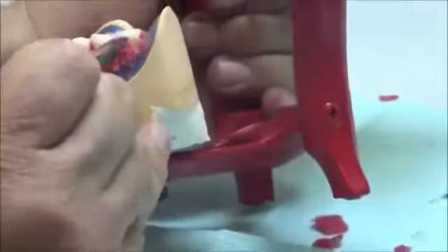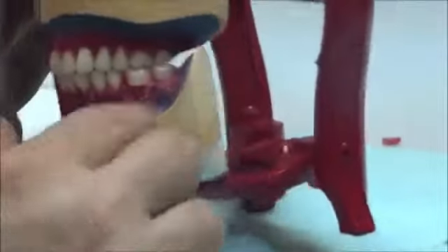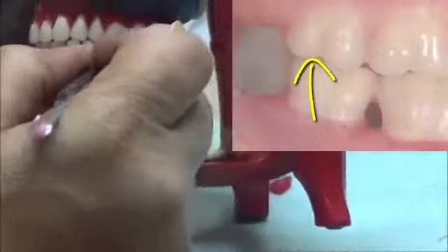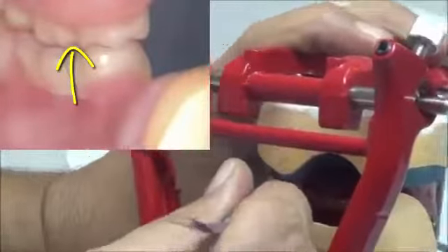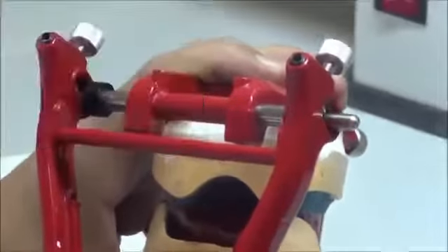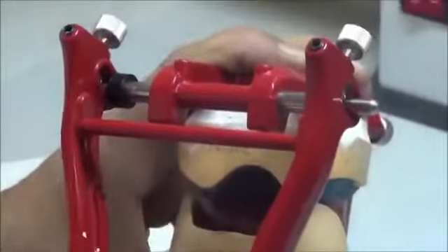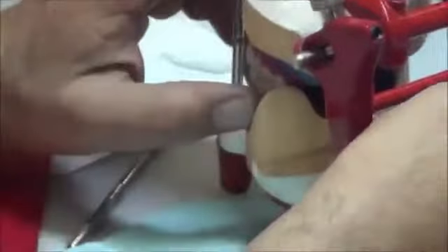So we finalize its tilt, we remove excess wax, we make sure it's interdigitating with the upper perfectly. If it's not, we just raise it from beneath. So I stab the knife beneath it, and we go lingually, and watch what to do. We try to take the tooth up by raising the lingual cusps to embrace the upper. Okay, so the tooth is in total contact with the upper 7. So we make sure of the interdigitation, I could see no space between the teeth, and now also I don't see them buckling.